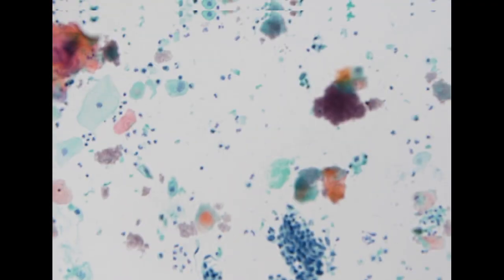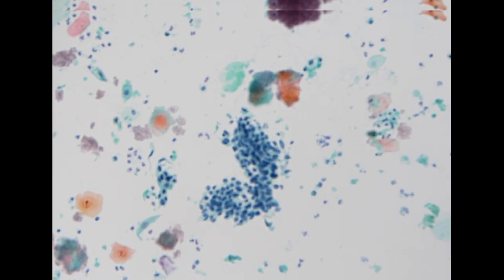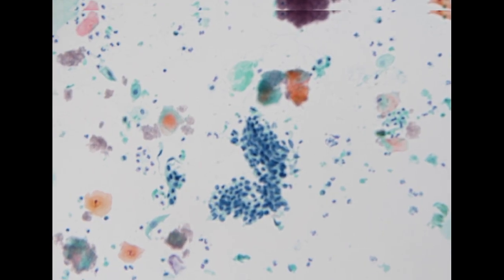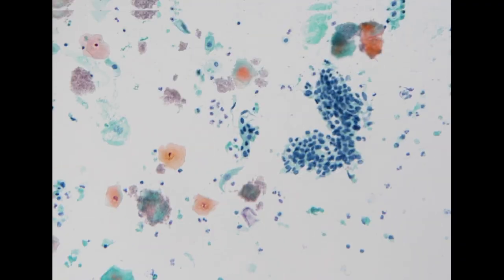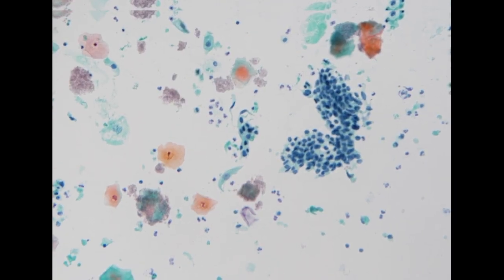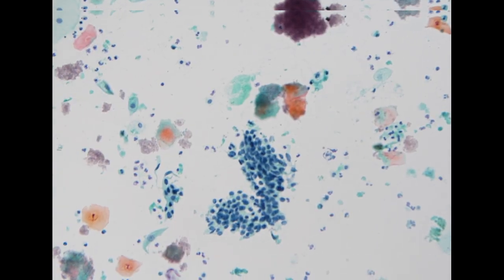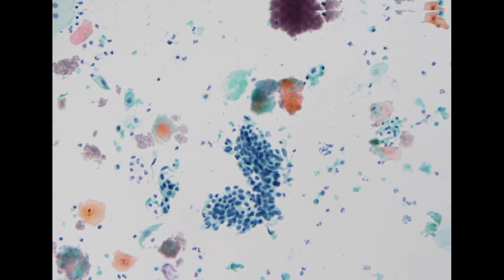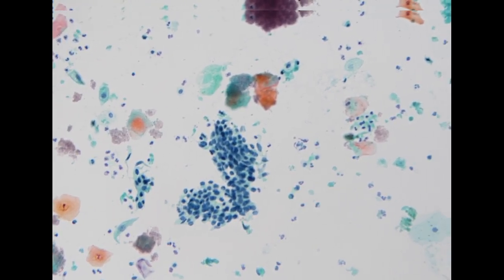For the voided urine specimen, we can imagine the abnormal cells can be coming from throughout the entire urinary tract, from the upper urinary tract, including renal pelvis and ureter, to the lower urinary tract, including the bladder. Usually for a primary bladder lesion, we will see more tumor cells. However, occasionally we can see very scant tumor cells. Additionally, carcinoma in situ usually sheds fewer tumor cells than papillary tumor, and upper tract urinary carcinoma usually sheds less in the voided urine specimen.